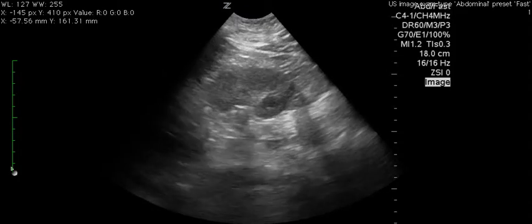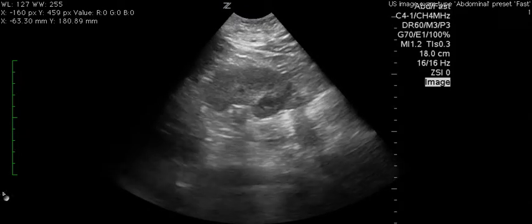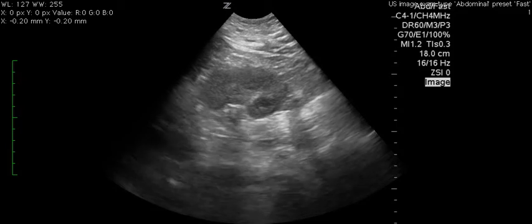Another view was here, and again you don't really get a good view of the spleen, which makes the left upper quadrant difficult to assess for free fluid.